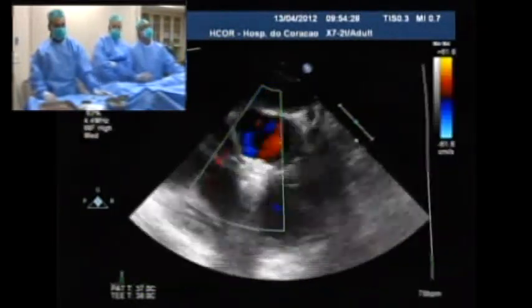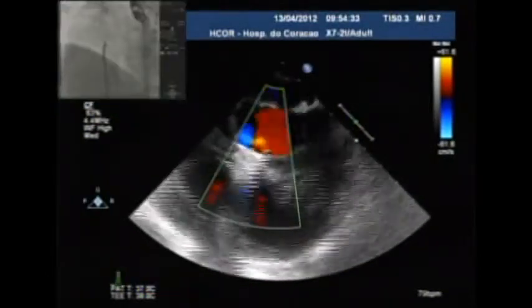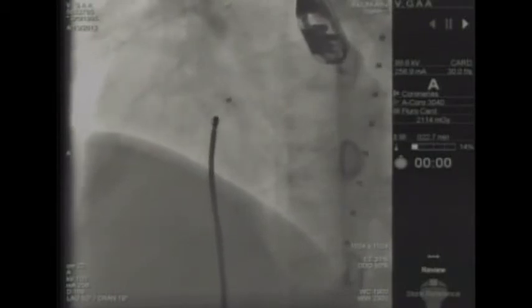Can I see the fluoroscopy? Can you do a case like that without echo? No, we are not doing any angio, because this guy had a severe anaphylactic reaction here. It was tough to control. That's why we were sort of anxious to come on air.